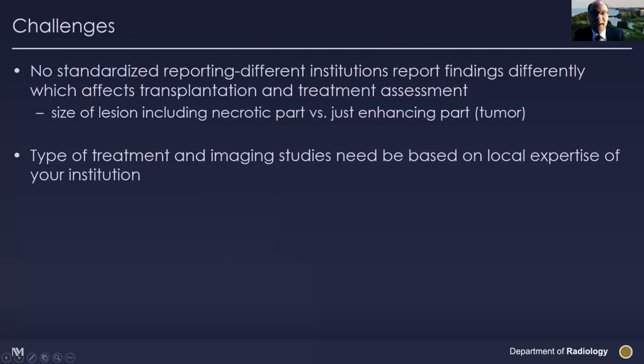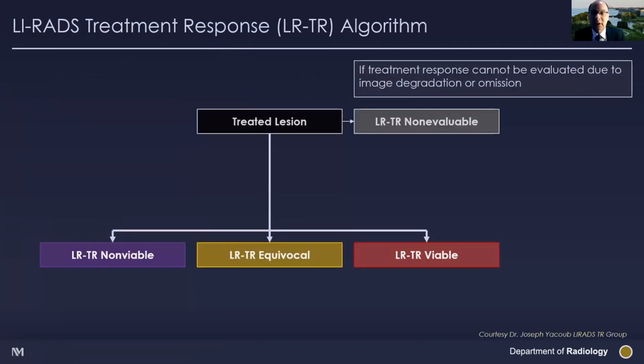As I want to emphasize, again, there's no standardized reporting, and the type of treatment and the imaging study should be based on your expertise of your own institution. This is a nice slide that was lent to me by Joseph Yacoub. I'm part of the LI-RADS treatment response group, but you can see that for the treated lesion, you evaluate whether it's non-evaluable because of image degradation or omission, and then you put it into 3 categories: either non-viable, viable, or equivocal.